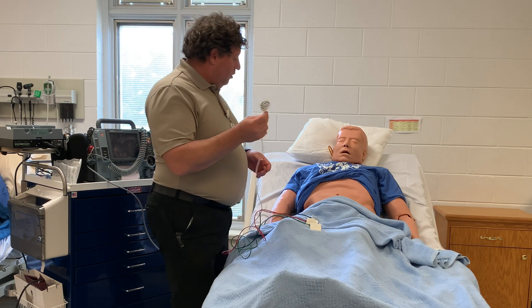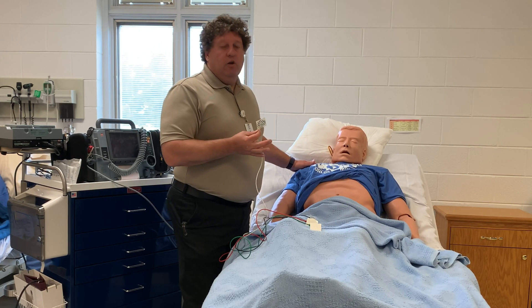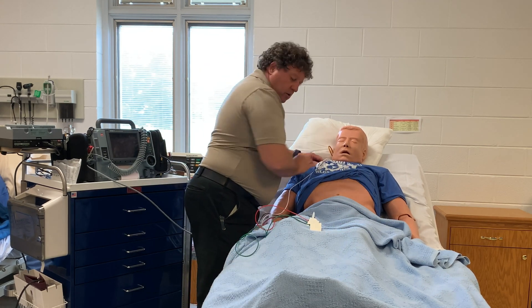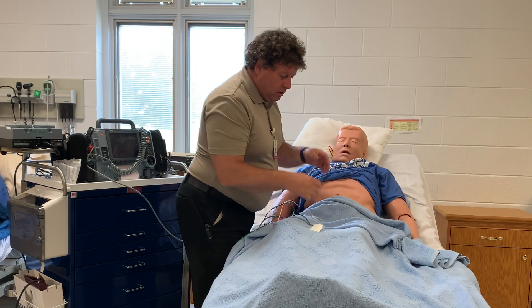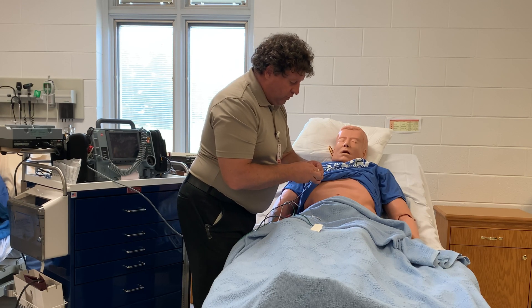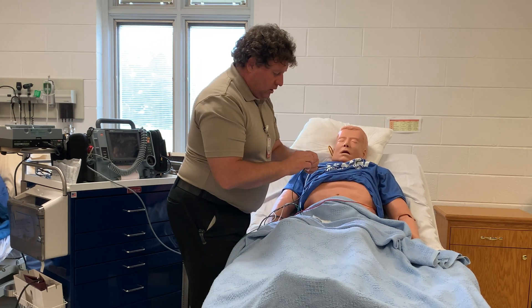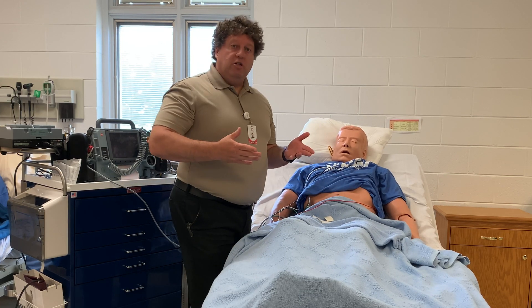So you've applied the electrode to the wire. Some people recommend cleaning the skin with alcohol — you can do that. I generally don't take the time unless the patient is extremely sweaty, diaphoretic, or dirty for some reason. We just peel these off and attach them to the correct spots: white to right, red to rib, black was left over, and then the green on the right leg. And that's how you attach the patient to the monitor.